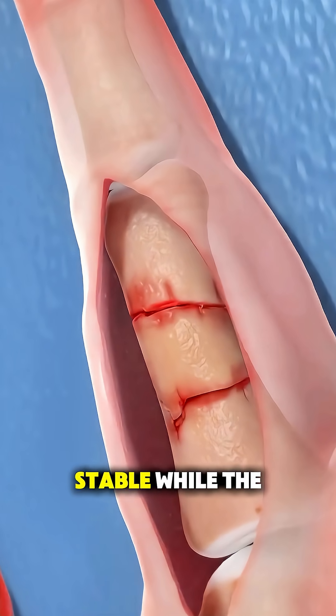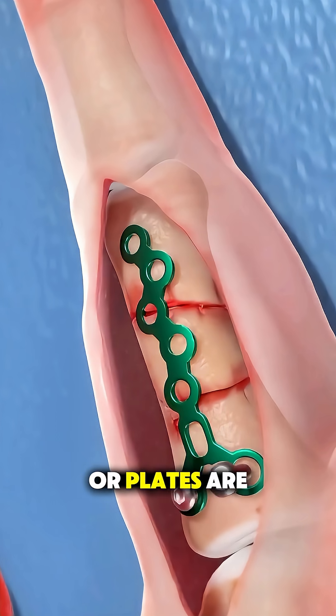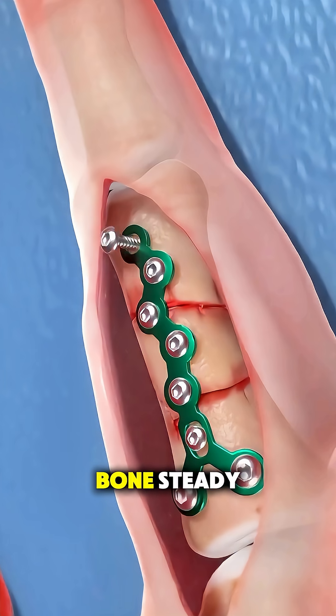To keep everything stable while the bone heals, tiny metal pins, screws, or plates are placed — think of them as internal supports that hold the bone steady.